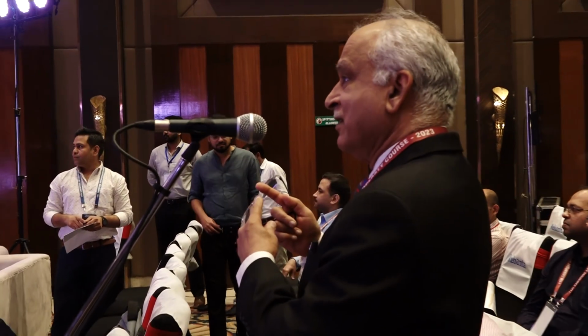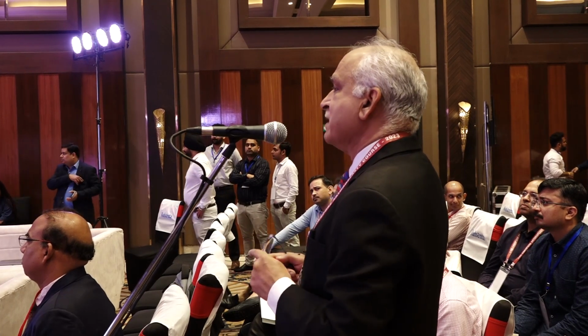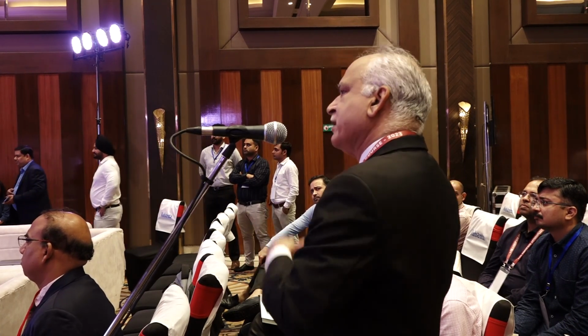So it was quite stable, and if you note, we have used a varus valgus constraint. So on the table, stability is not important. What happens when she walks? What happens when she walks for 5 years? That's the question. She'll be fine for 1 year maybe with your constraints. Let me tell you, if there is a valgus opening, even a hinge does not stay. After a while, even the hinge opens up or something happens or a fracture happens. So you cannot play with an MCL which is a little doubtful. You cannot give an alignment not friendly to your MCL. So all alignments have to be friendly to your MCL.